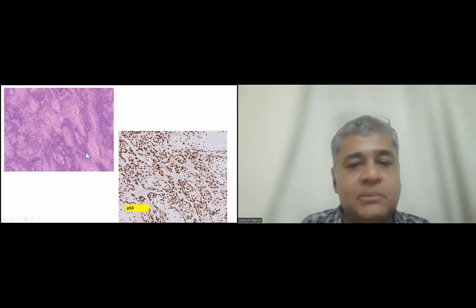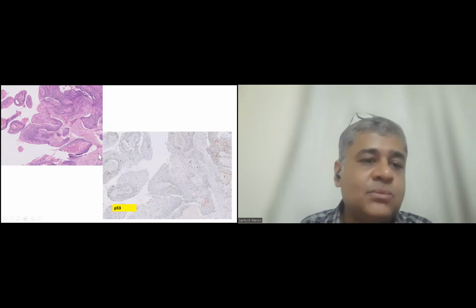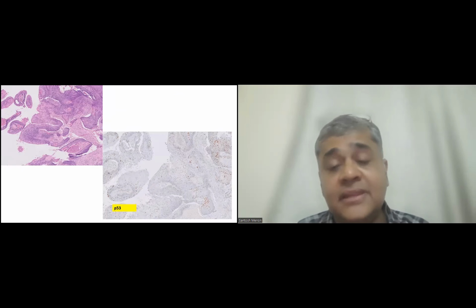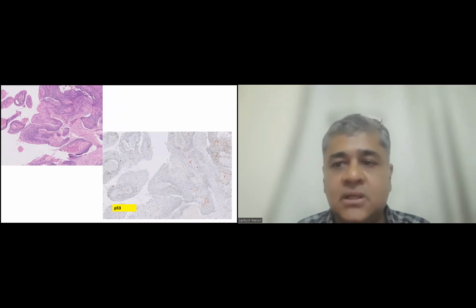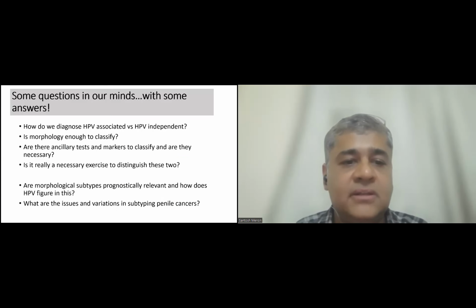This is a usual squamous carcinoma, which is very strongly and diffusely positive for P53. And this is a warty basaloid carcinoma, which has this patchy kind of staining of P53. So sometimes you may end up doing these stains and they may aid, but they are not 100% to be believed. You have to believe in your morphology, and look at other features to aid in the clinical management.